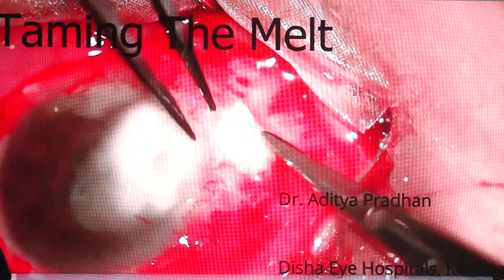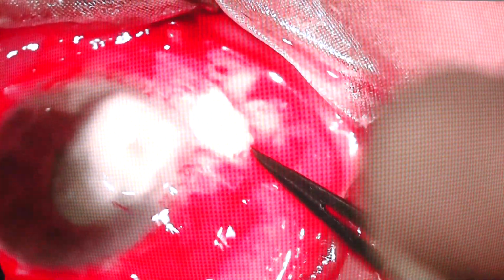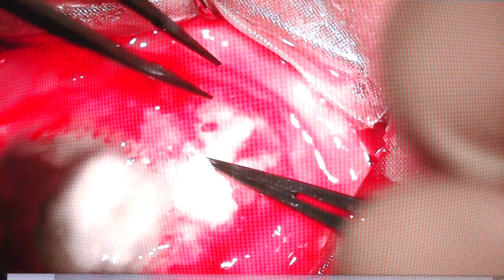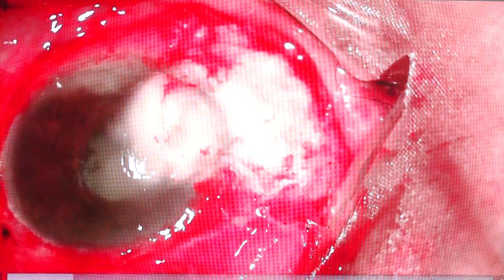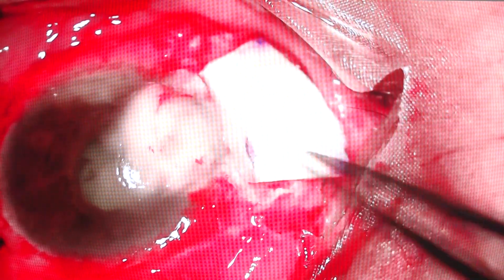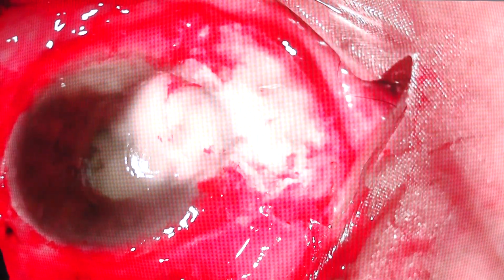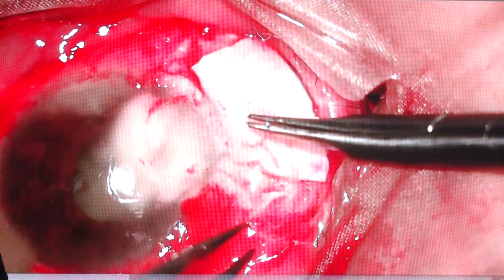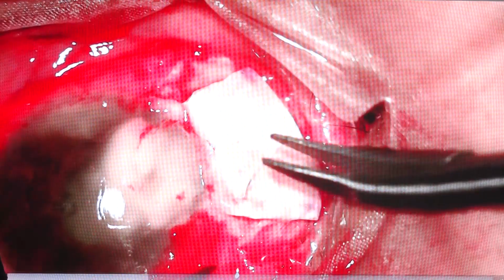This patient had undergone a pterygium surgery elsewhere, maybe a bare sclera technique, there were no records available, and then presented to the clinic with this. There was a full thickness corneal abscess where the pterygium head was supposed to be, and a scleral melt which was infected. This later proved to be fungus. So the plan is to fashion a Tenon's patch graft to apply to the area of the scleral melt, and also do a large diameter eccentric therapeutic corneal graft to take care of the corneal abscess.